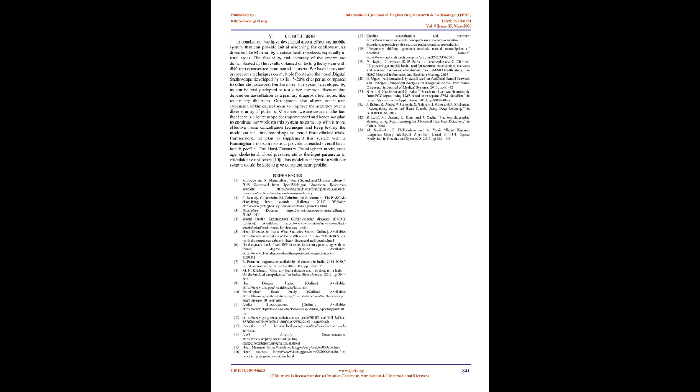Experiment 4: real-life heart sounds collected by our stethoscope. The digital stethoscope developed as part of the project was used to record heart signals of people ranging from 15 years to 70 years. These heart sounds were then classified using the CNN model trained with open-source datasets. As per the results presented in Table 2, we achieved 6 correct classifications out of 7 tests performed, 6/7 equals 85.7%. Due to the current COVID-19 situation, we were able to test only a few people. Once the condition alleviates, we will begin large-scale testing of our system.